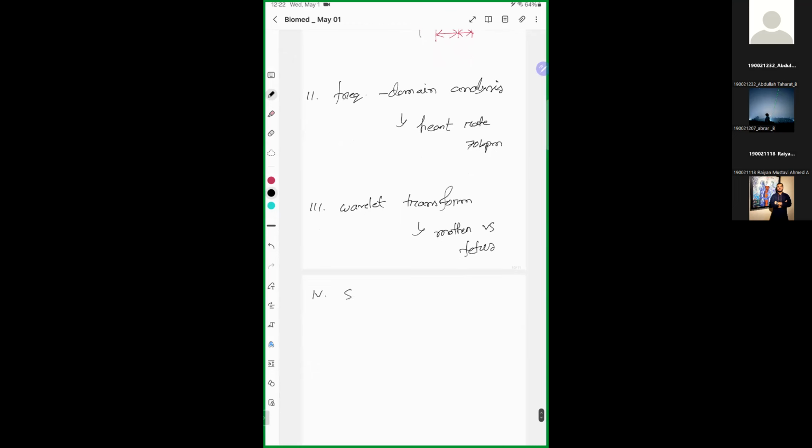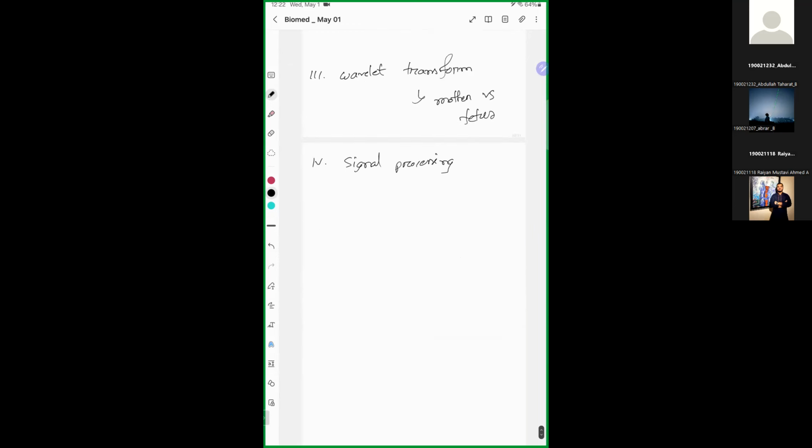And the other thing is simple signal processing measures, for instance, the peak analysis I just mentioned. You can analyze the peaks. That is one thing. Also, the distortion. You can measure whether your signal is distorted.